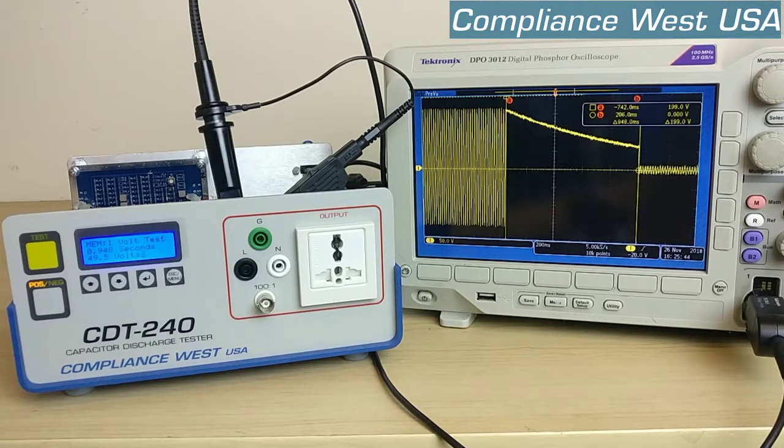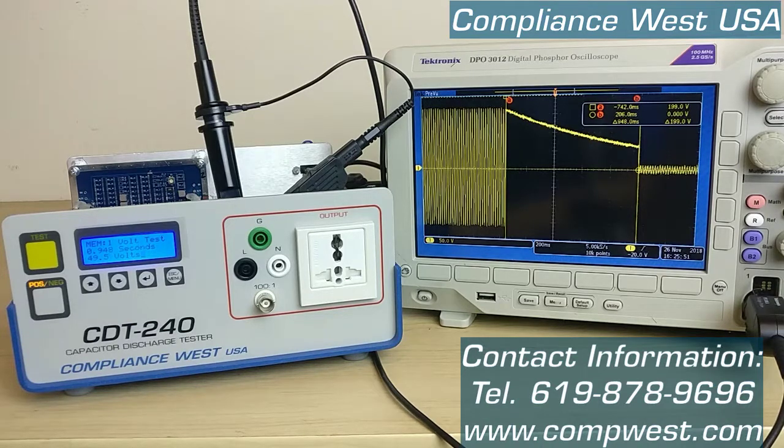So that is how you perform the test. If you have any questions feel free to contact us at our phone number 619-878-9696.